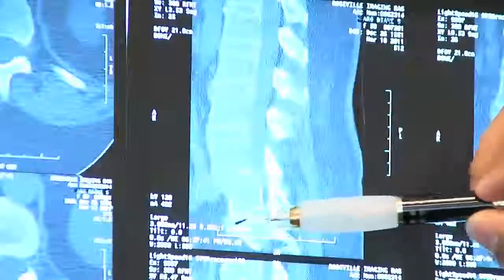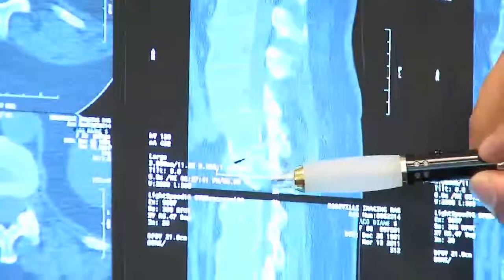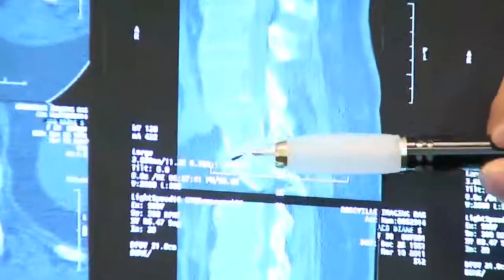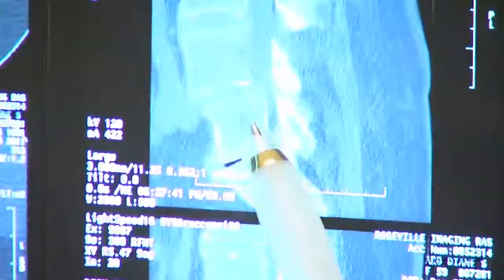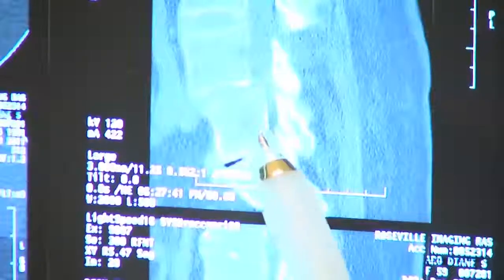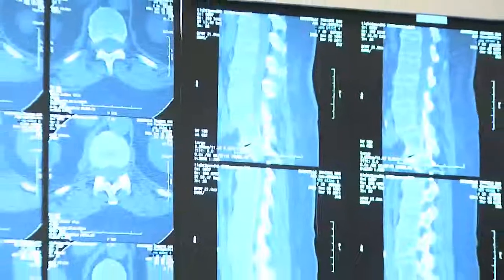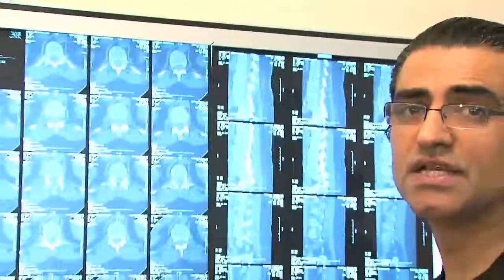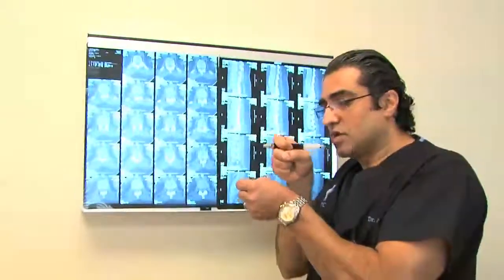In this example you can see that this patient has severe L5-S1 disc damage with bone-on-bone contact. Not only that, the patient has a spondylolisthesis of L4 over L5, which is the slippage of one vertebrae over another — you can see it very clearly right here. This slippage can happen because of degeneration of the disc — if the disc loses its integrity and starts getting weak, it settles and the vertebrae above can slip.